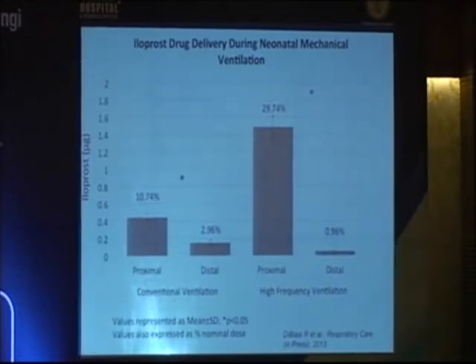And I think that has to do with the fact that we're using a much higher frequency than we would during conventional ventilation. There's some suggestion that maybe during the active exhalation of high-frequency ventilation, you're dragging some of that nebulized material back into the circuit, so that you get a big bolus with the next breath. I don't know why. I'm still trying to figure this all out. A couple of my engineering friends who are into fluid dynamics are perplexed by our findings. But other people are studying this now too, and finding out that you get more medication delivery during high-frequency ventilation than you do during conventional ventilation. So that's a good take-home message.